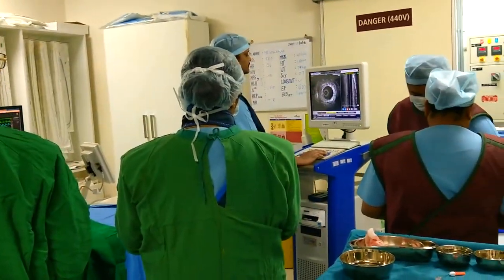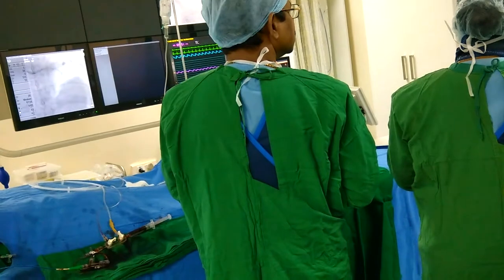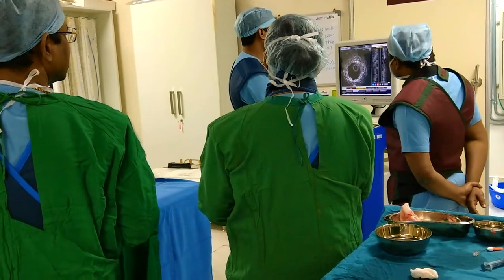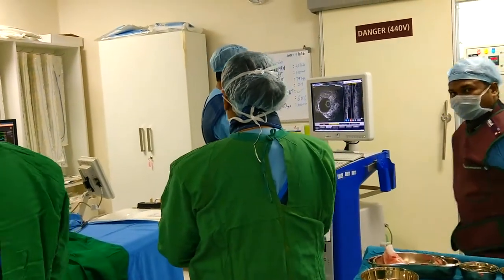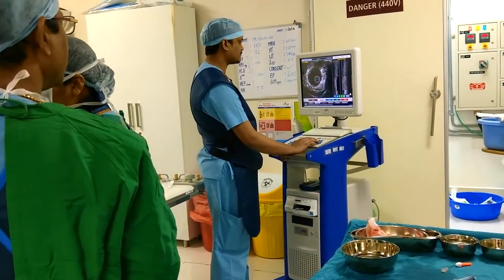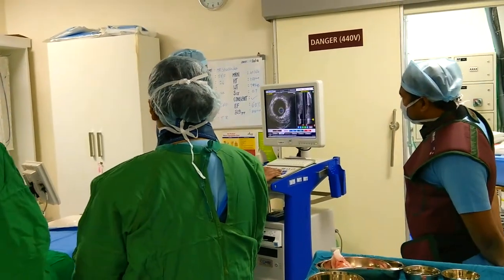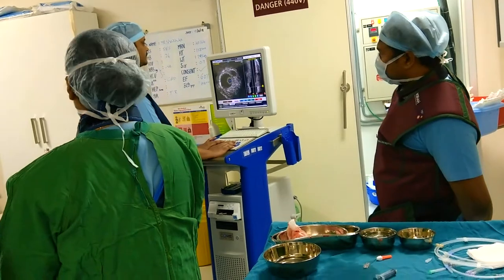We are carefully observing the plaque, side branches, and patient complaints. This is the left anterior descending artery, left circumflex branches, and then left main. This procedure is very safe and takes almost 10 to 15 minutes.